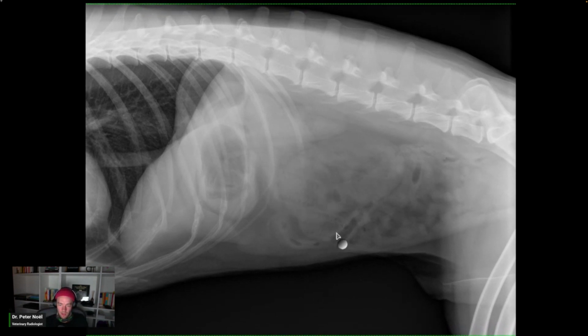These right here and these right here. Okay, so barbecue, July 4th in North America. There's a lot of corn. So these are corn cobs. When you see the corn cobs, you go, all right, well, fine, we've got corn cobs. But where are the corn cobs? Because you don't want to have a negative explore. So you want to find out if they're in the colon.